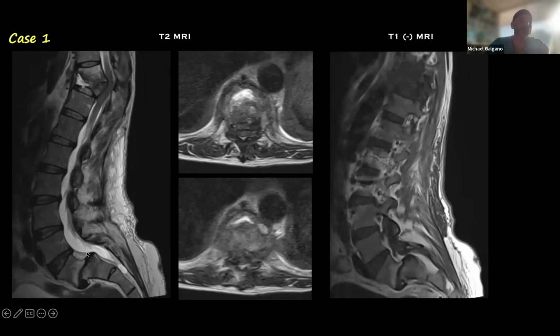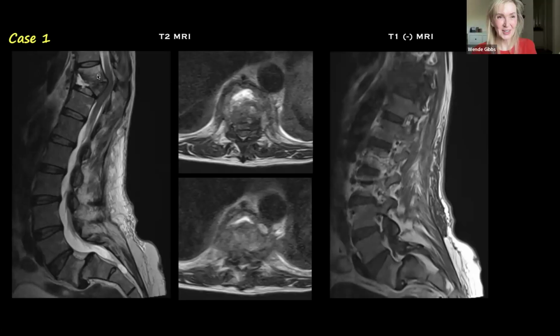No, at the fracture. So two separate issues, right? She's got a lytic spondy at L5-S1, which is why they called us. But then we obtained a thoracic MRI too, and we found that she's got this T9-10 pathologic fracture. Pathologic fracture collapse, and then you've got that triangle of fluid signal, right?